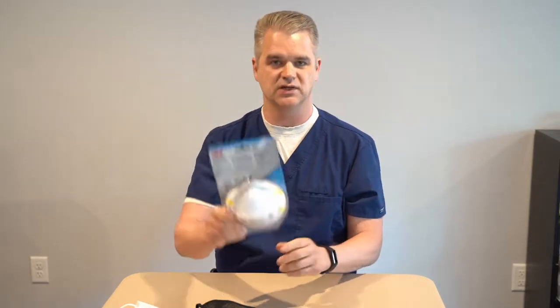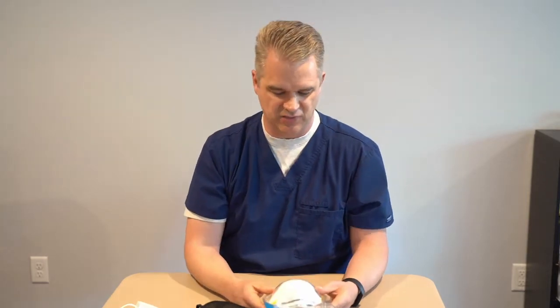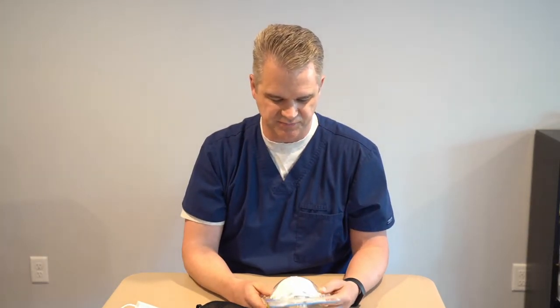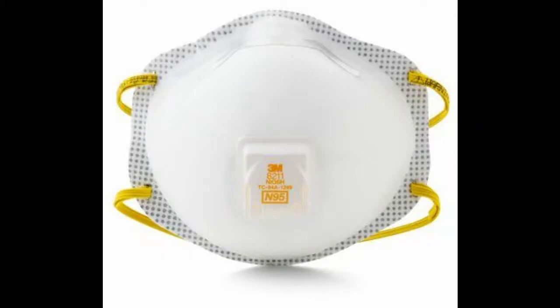I was able to find one here. It is a construction grade N95 by 3M called an 8210. And the 8210 actually doesn't have any type of vent on it. I do know that, I think it might be 8211, I'm not sure what the number is, but it does have a vent on it, and that just doesn't work very well for the hospital or clinic. Nobody can tell you what to do when you're out in public. The recommendation is for you not to wear a vent though, because basically it's defeating the point of protecting others.